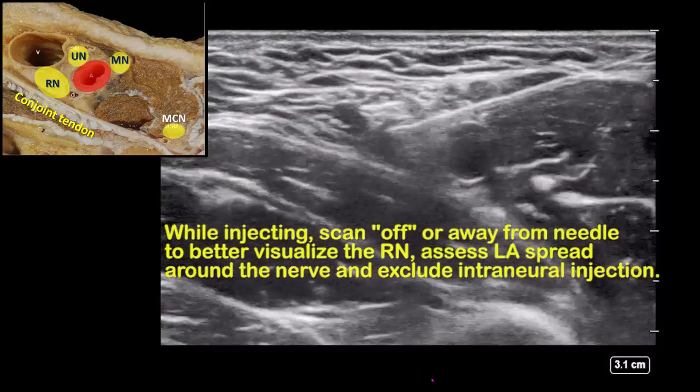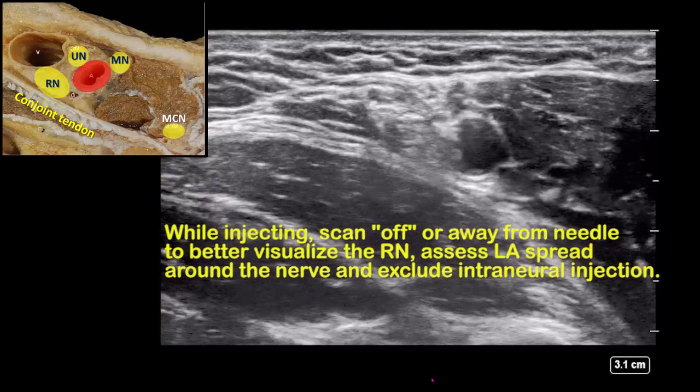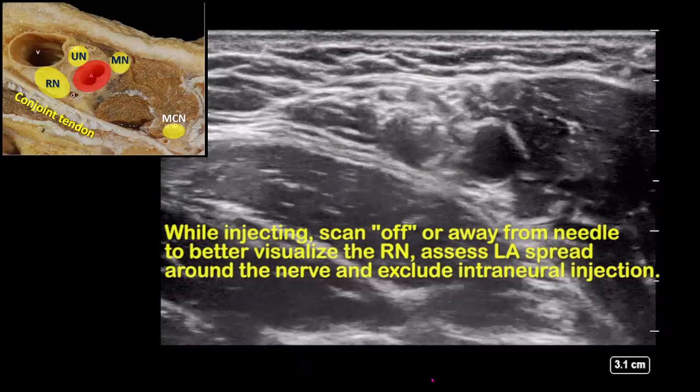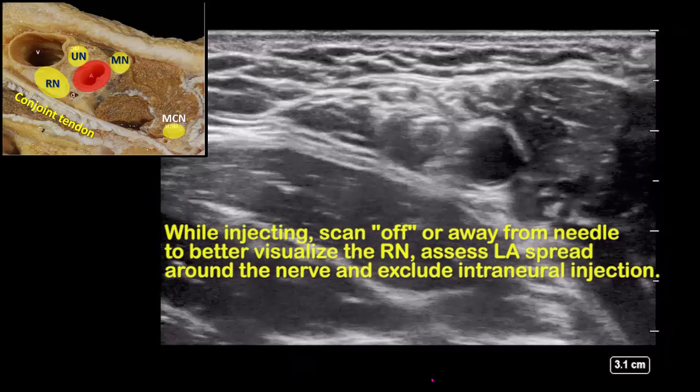The radial nerve is in the shadow of the needle, so slide the probe away from the needle to visualize the nerve better and to see that local anesthetic spread is filling the compartment and outlining the nerve.